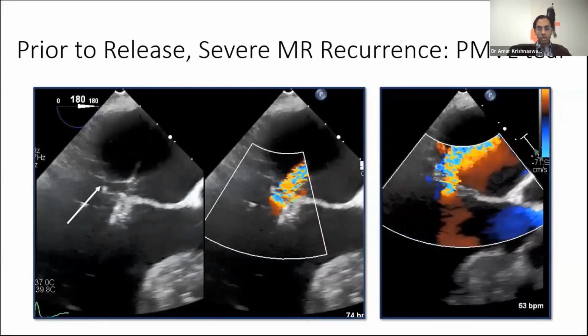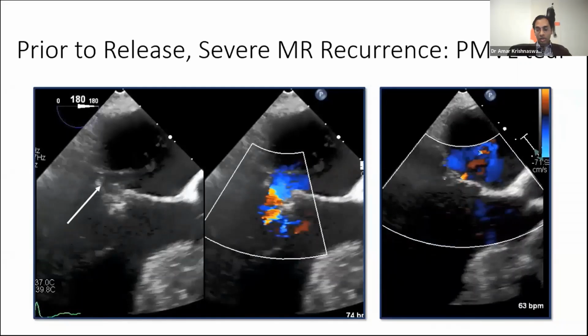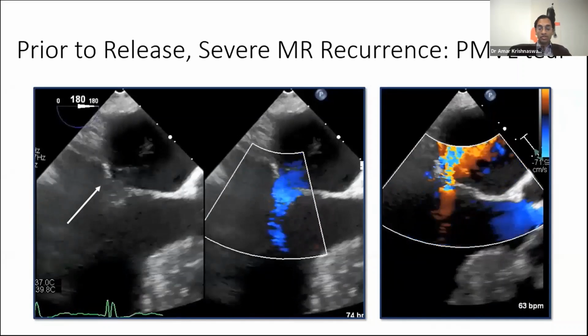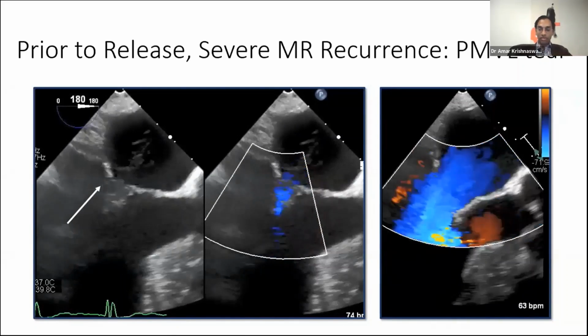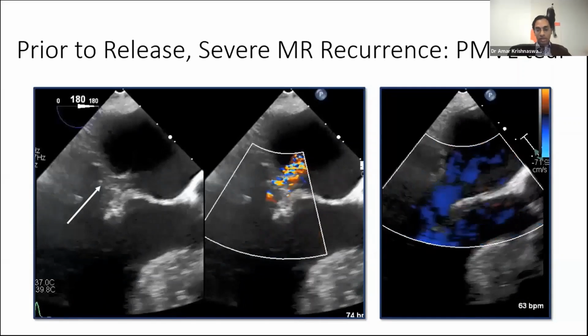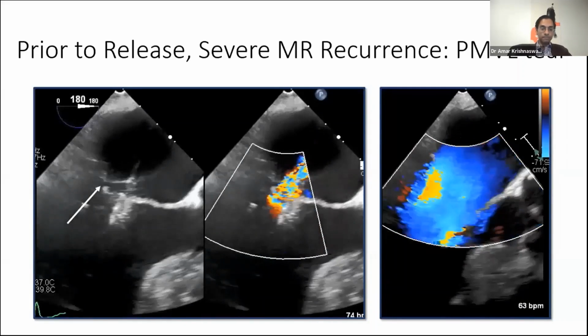And so this is a situation which is certainly not common, but in some series you can see almost anywhere between 3 and 5% of the time a single leaflet detachment, either due to tear of the leaflet or in fact due to slipping off of the mitral clip itself. When the mitral clip slips off, of course, it's a little bit easier to handle because you can just hopefully recapture the leaflets, but this is a more complex scenario.